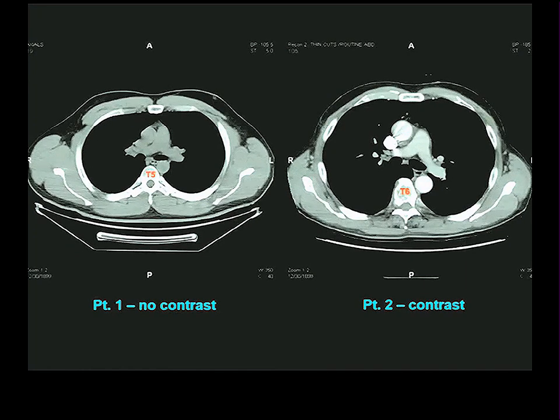I showed you a CT without contrast, all right? Lots of people get CTs with intravascular contrast. They put a catheter in your antecubital vein, and they inject a radio-opaque substance and follow it through your circulatory system. Now, depending upon when you take your CT, and they are timed, it'll be almost entirely in the venous side of the system, or the right side of it, and then it will eventually travel to the left side of the system, out to the systemic arteries. Now you can see, here is a person who's had contrast.